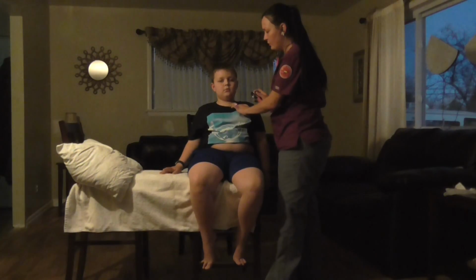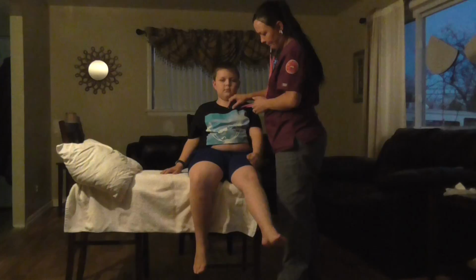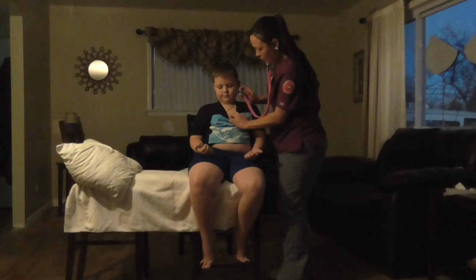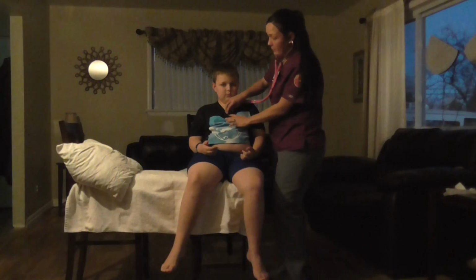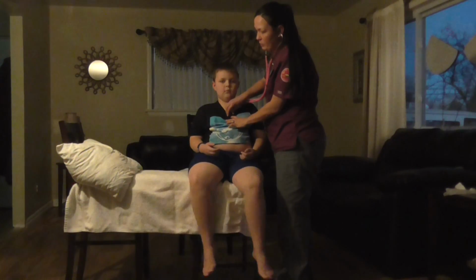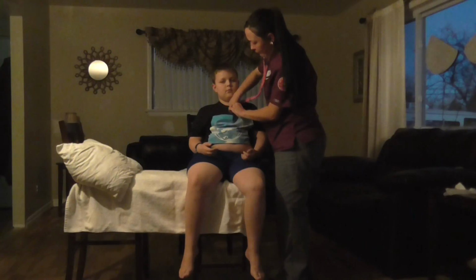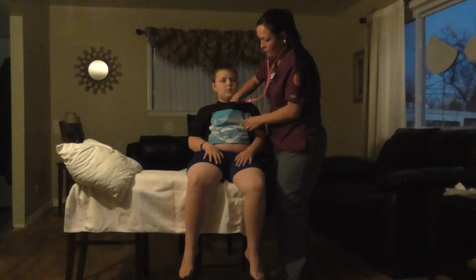Then I would go to the left sternal border, down to the second intercostal space to listen to the pulmonic valve. Rate is normal and strong. I would then go down 2 more spaces, 1, 2, on the left sternal border as well, to listen to Erb's point for any murmurs. I hear no swishing or any signs of any murmurs. Could you hold still, please? Then I would go down 1 more to the tricuspid valve. Strong and rate is normal.